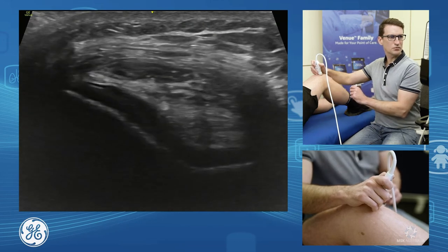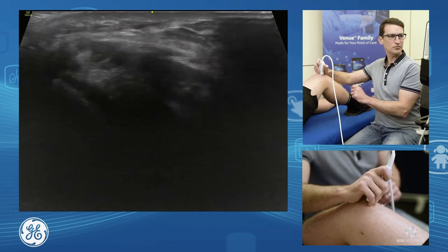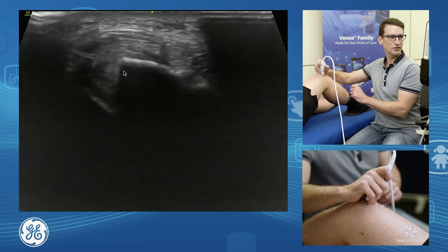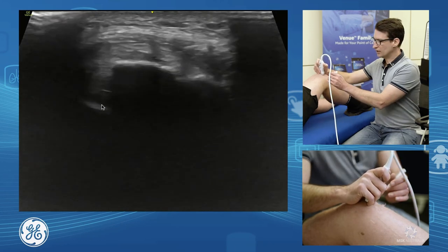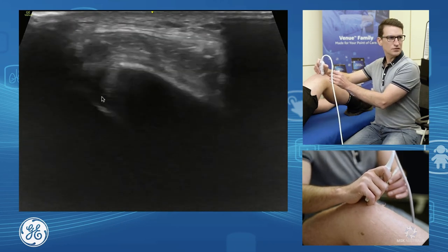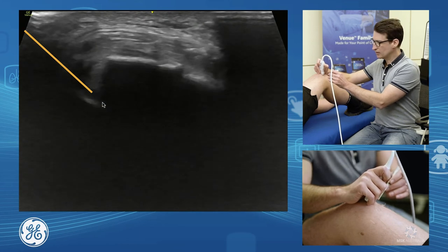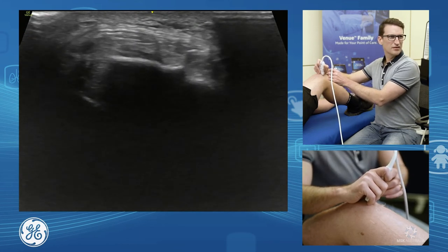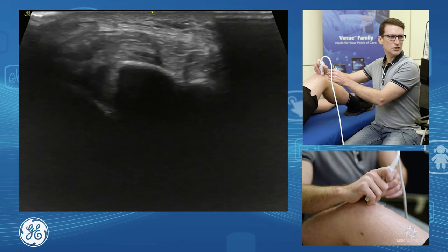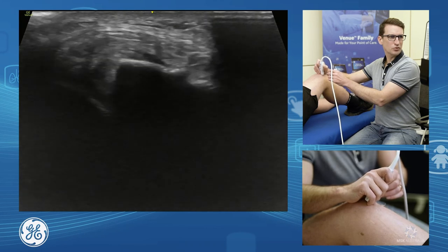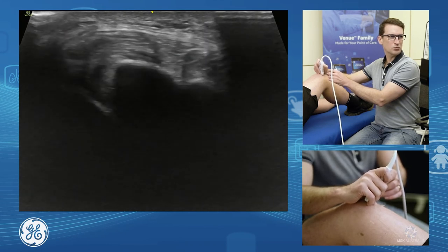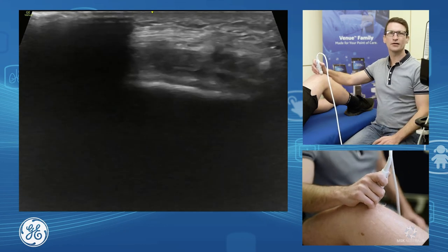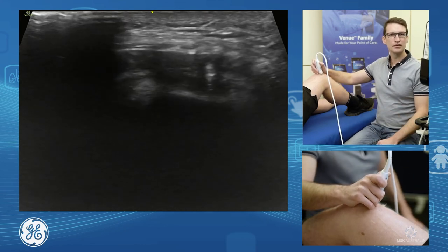Another option, if we're limited by the amount of fluid, is to come down so we can see our patella and femur, and just fall into that little V shape. What we want to feel is just a lack of pressure — we don't want to see the injectate pooling. We want to know it's running away, so as we're pushing the plunger, the fluid is running away. And that's our anterior knee.